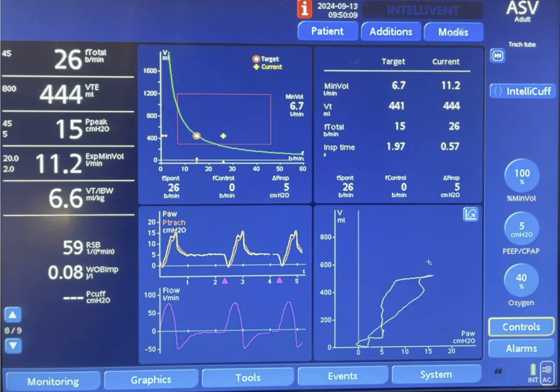Excellent. So now the question is why this is happening. The minute ventilation that the patient is getting right now is 11.2 which is higher than the targeted minute ventilation which is 6.7.